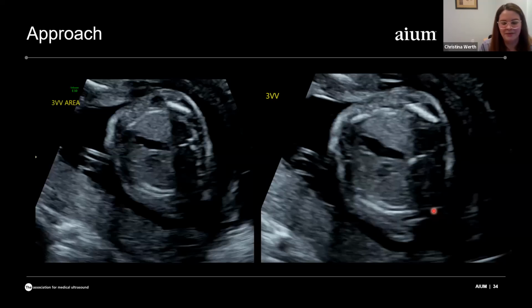I think that's one of the biggest takeaways that I can tell. Even if you think that it doesn't look the way it's supposed to look, this picture still gives us tons of information about what's going to go on. And Dr. Jansen's going to talk about a lot of different cases where this view alone really gave a lot of insight to the diagnosis on multiple different cardiac defects. So that's my pedestal that I'm standing on. I just want to give everyone that reminder.